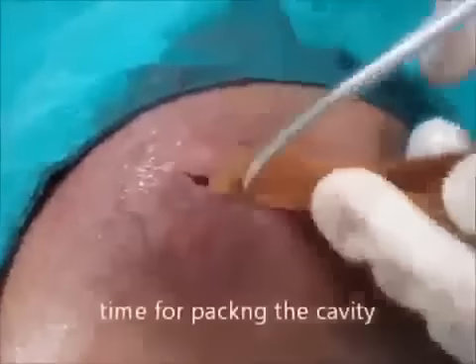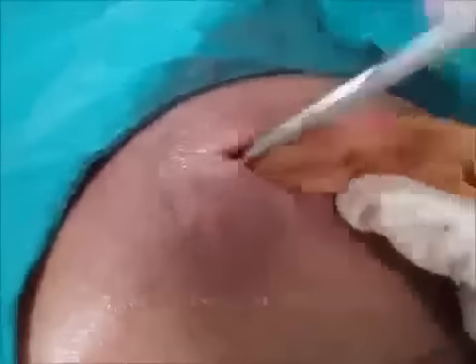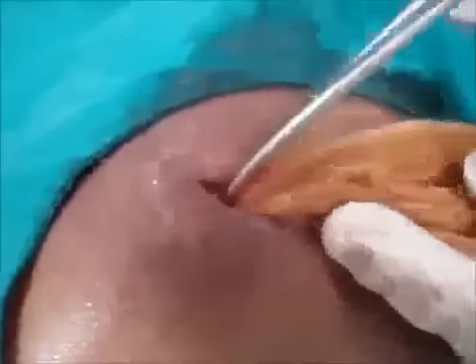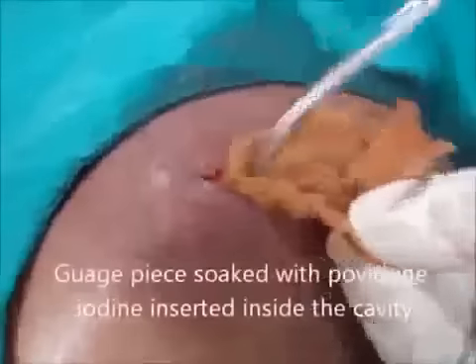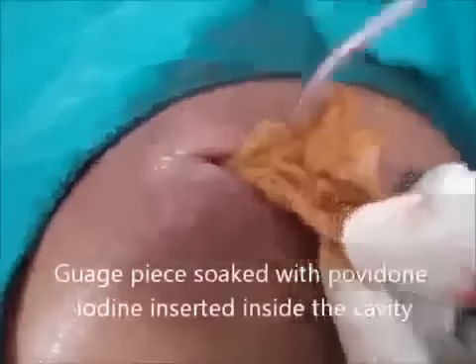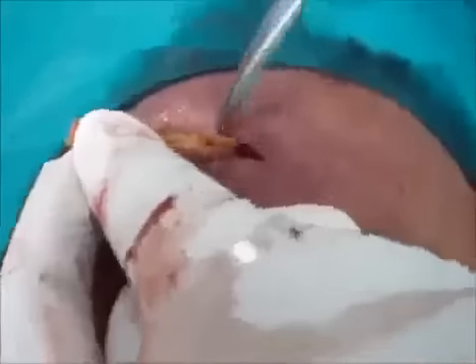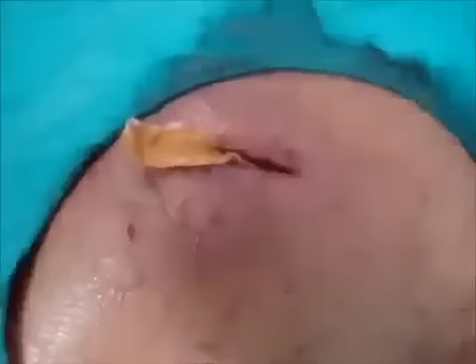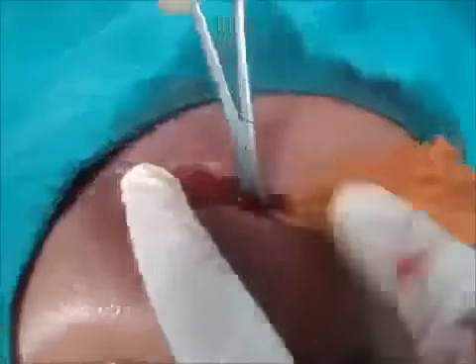It's time to pack the cavity. Povidine iodine soaked gauze pieces are inserted to pack the cavity. As the cavity was big, two pieces were inserted.